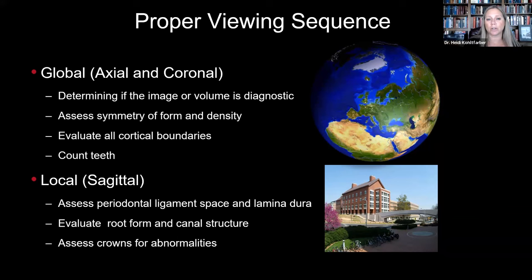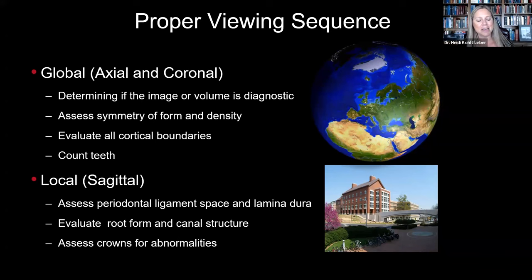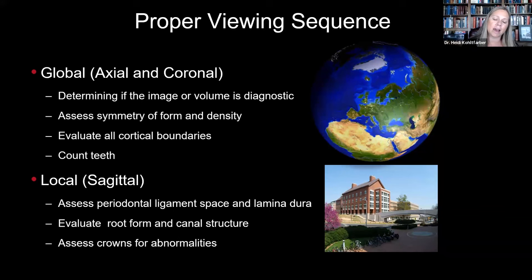We want to look at the symmetry of form and density and evaluate the cortical boundaries. We can't differentiate soft tissues well with CBCT, so we spend a lot of time looking at those cortical boundaries — if they're not there, it could tell us there's a pathology. We can look at everything related to the dentition, but we can see it a lot better in the sagittal sections, where we can look at the periodontal ligament space, the lamina dura, evaluate canal structure, or assess crowns for abnormalities.